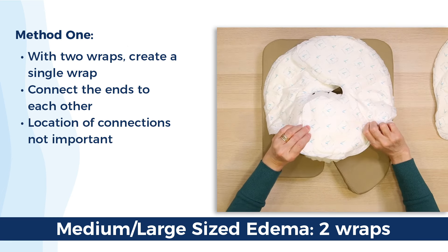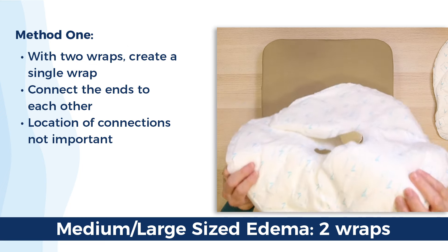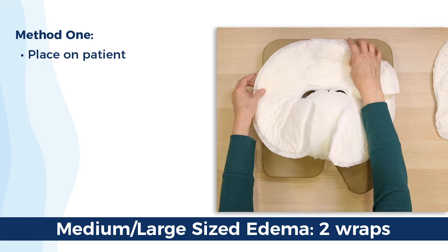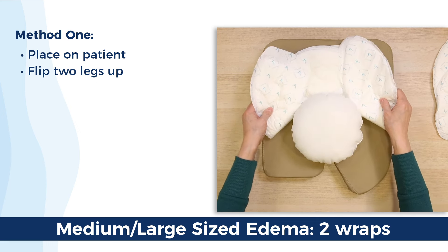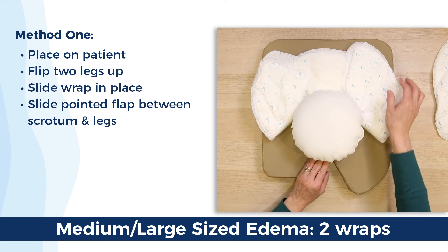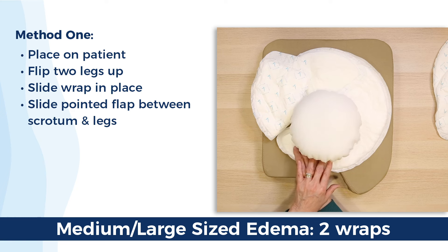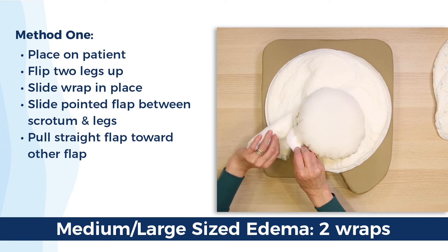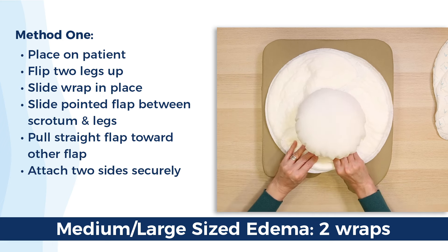Don't worry about the location at first — the velcro will go anywhere on the backing, and we're going to be adjusting the size of the QuickChange to accommodate your patient. Make your double-size wrap and place it on your patient's abdomen, flipping the two legs upwards to get them out of the way and help you slide the wrap gently into place. Gently lift up the scrotum, separating it from the legs, while taking the pointed side and bringing it under between the scrotum and the legs. Now take the straight velcro side and, using the pointed side as a lever, pull them together slightly and attach the two together. Make sure this attachment is secure — now you have a circular wrap.